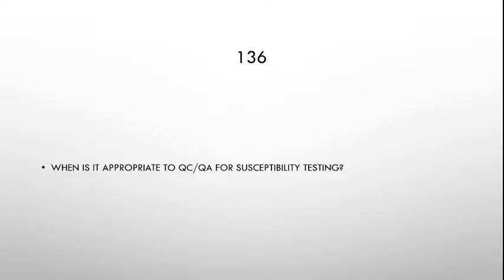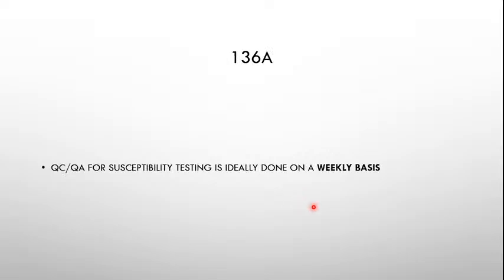All right. Wonderful. Now, when is it appropriate to do QA QC of susceptibility testing? It's done on a weekly basis. It can't be daily, okay? The microbiology technicians would get tired. Imagine, one patient will probably require 5 to 10 plates, if you're using the small ones, the size of this. I took this earlier because I needed a comparison.